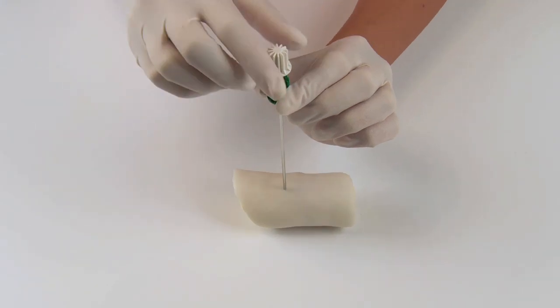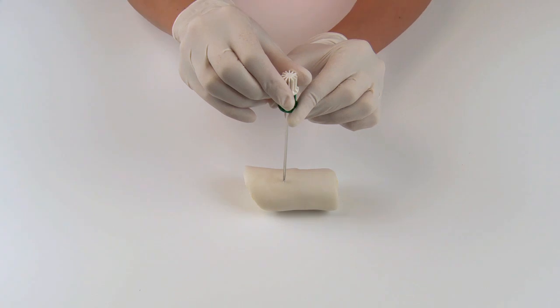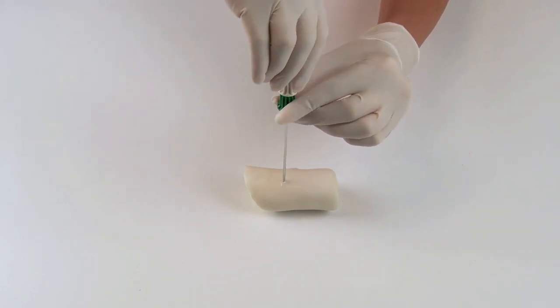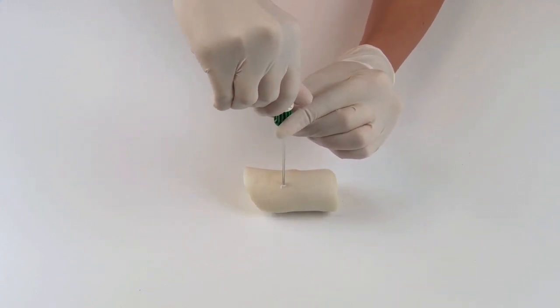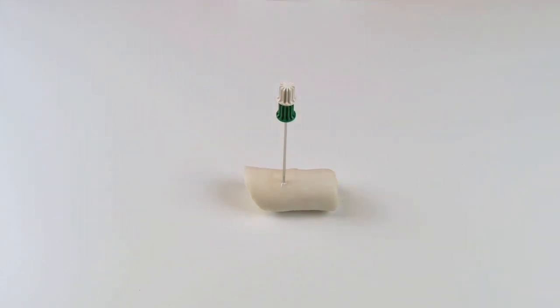Before drilling further, retract the penetration cannula to allow the wobbling movement of the eccentric drill. From an engineering standpoint, retracting the cannula exposes the eccentric drill bit, which allows the drill to make a hole that is larger than the cannula itself. Now continue to drill through the cortical bone. Use moderate axial pressure and as long turns as possible. When the drill has passed the cortical bone, advance the penetration cannula 2 to 3 millimeters into the cortex. Make sure that the penetration cannula is firmly anchored into the bone. Now remove the drill.